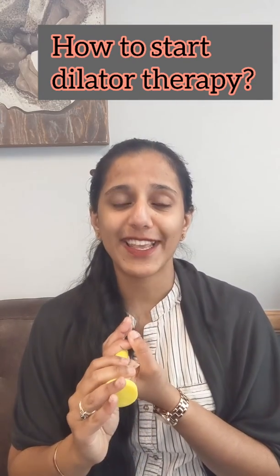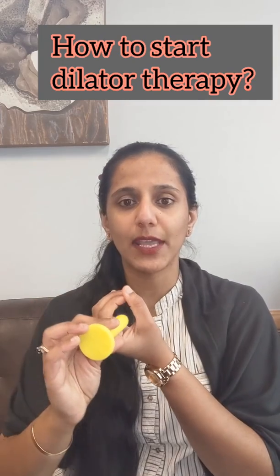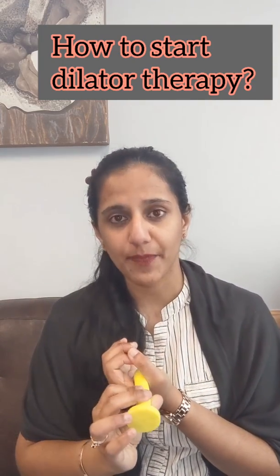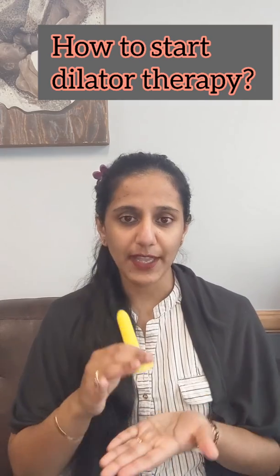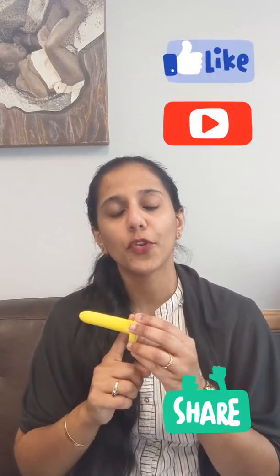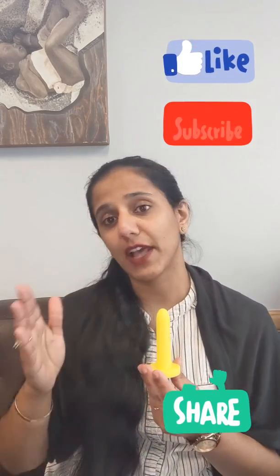And you will hold each position on that clock for about 30 seconds to a minute. And you will keep moving down and around, slowly widening your vagina in that spot. If it feels good to you, you can continue deeper and do the same. And again, you will practice this once it is pain-free to go to the very end and practice your dilation. That's when you will level up.